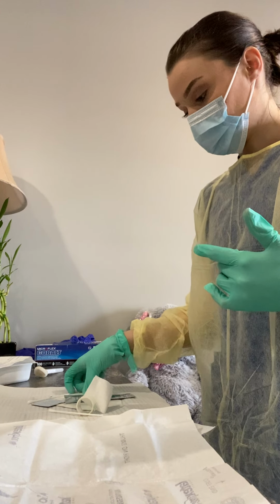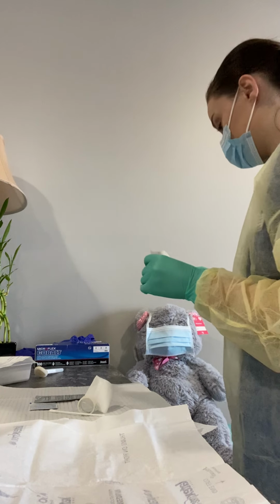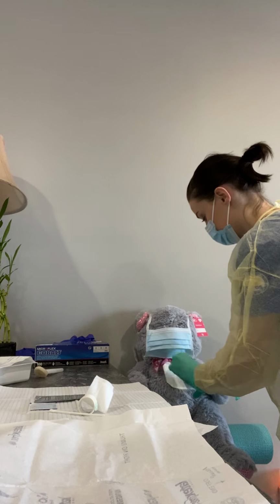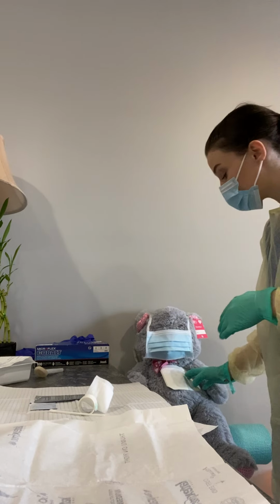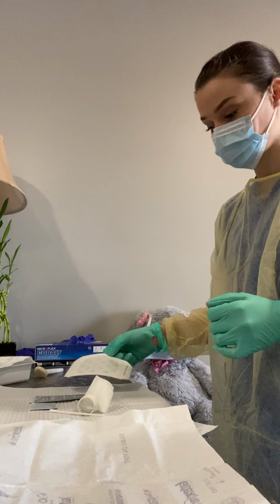If I didn't have the ChloraPrep, I could use iodine if she wasn't allergic and then complete that with alcohol. So I'm going to take my Tegaderm. I'm going to place it nicely over the site. And then got that taped on. I'm going to initial, date, and time the Tegaderm.